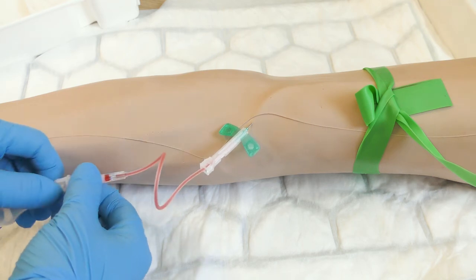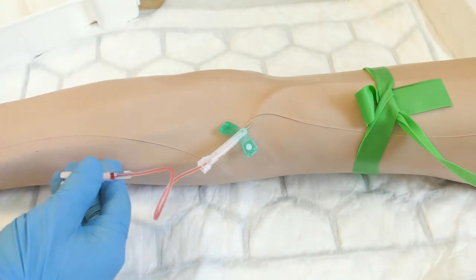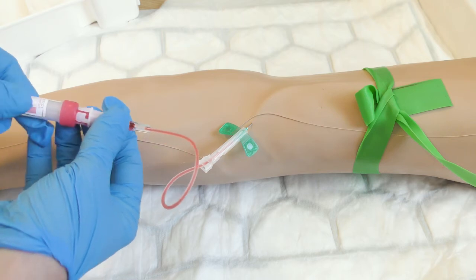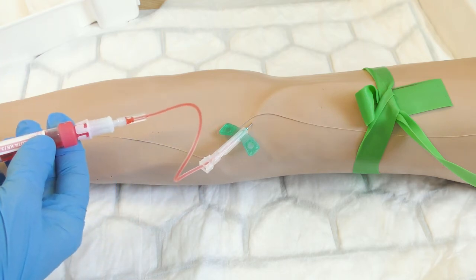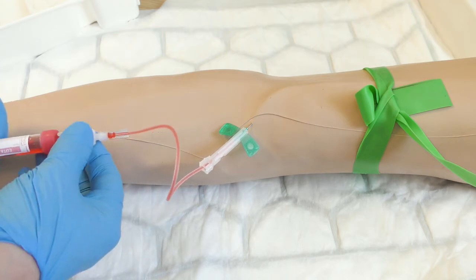If at this point any routine bloods are required, remove the adapter cap and then samples can be taken directly from the butterfly needle. Attach whatever blood bottles are required in the correct order. A discard sample is not required if a blood culture sample has already been taken.